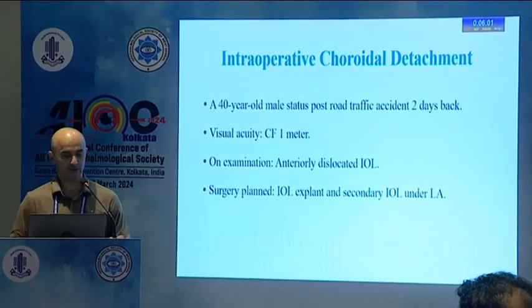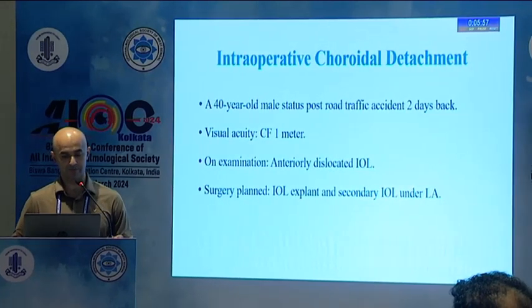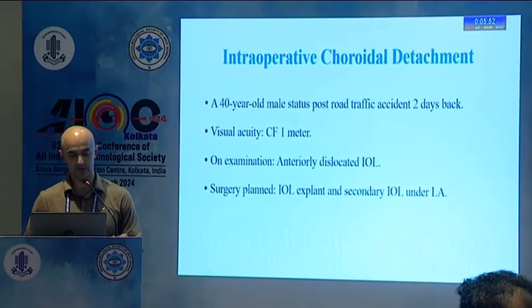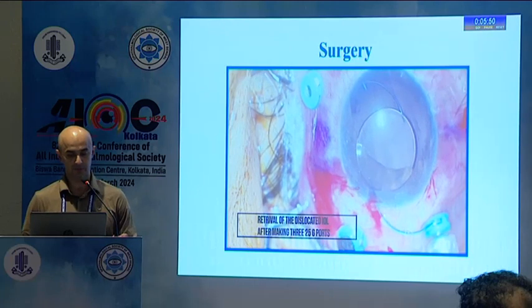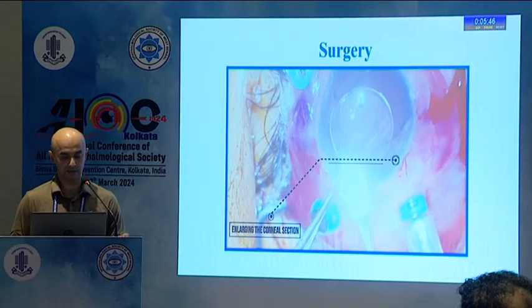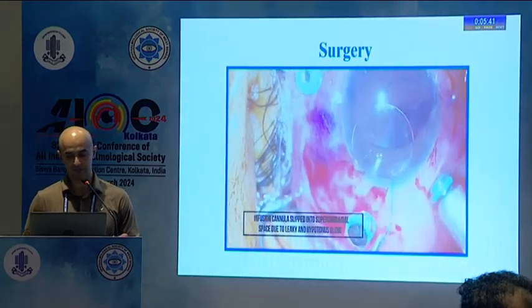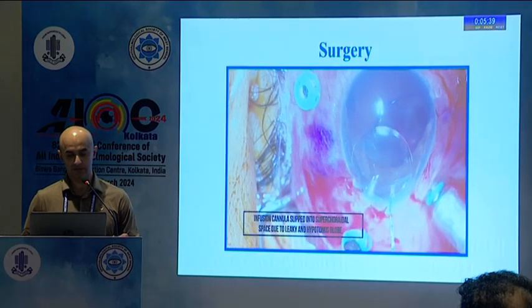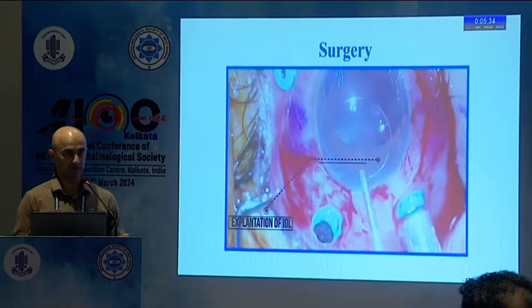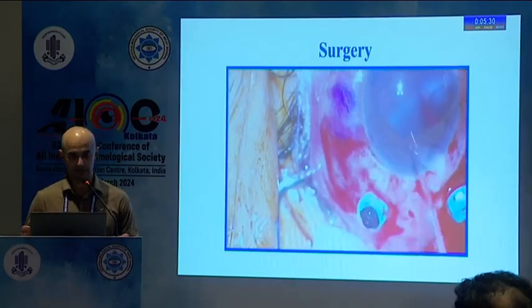Regarding intraoperative choroidal detachment — here is a 40-year-old male, status post road traffic accident, who came with one meter vision. On examination, there was anteriorly displaced IOL and surgery was planned for IOL explant and secondary IOL. The infusion cannulas are in place and I'm enlarging the limbal incision to explant the lens. You can see the mound of choroid starting to build up because of the open wound — there is hypotony and the cannula has slipped back.